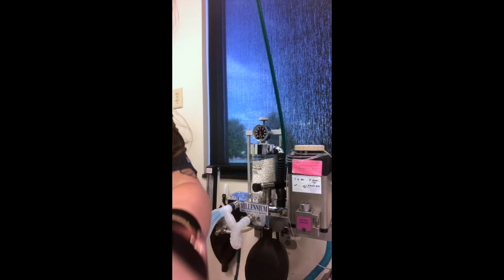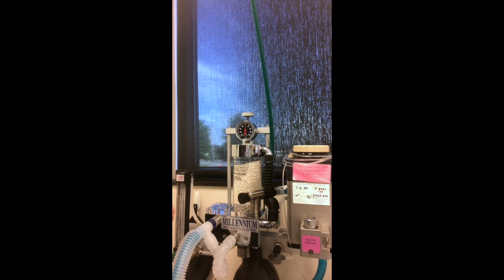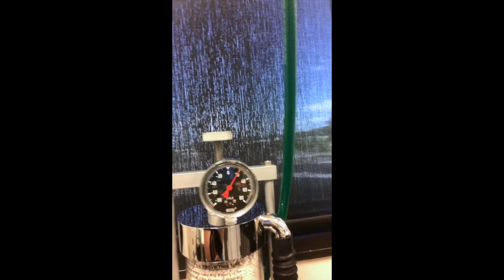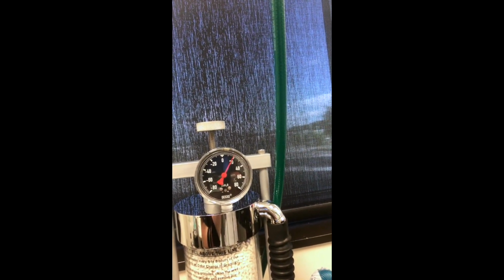And then you want to fill it to about 20 centimeters of water, and you want to hold that for about 5 seconds and make sure it doesn't leak. So that is a confirmed leak test. Our anesthesia machine is A-OK. There are no leaks.